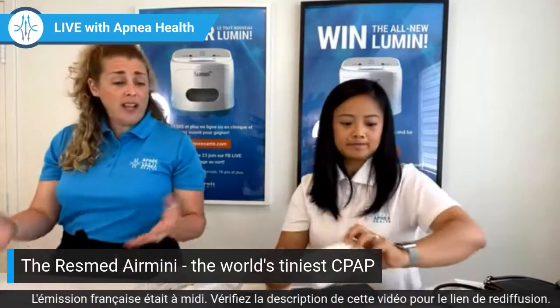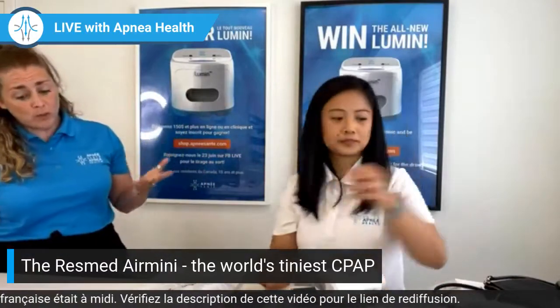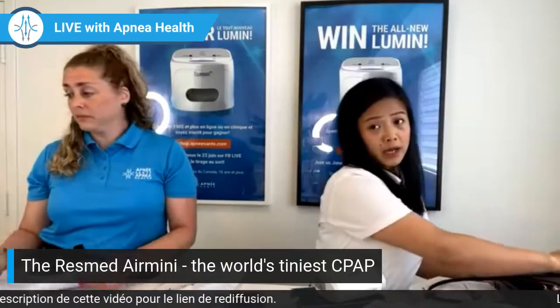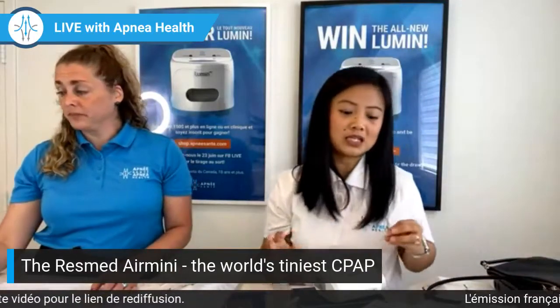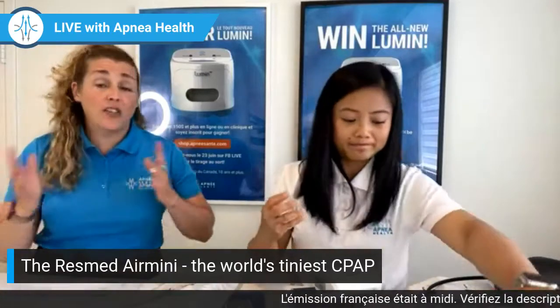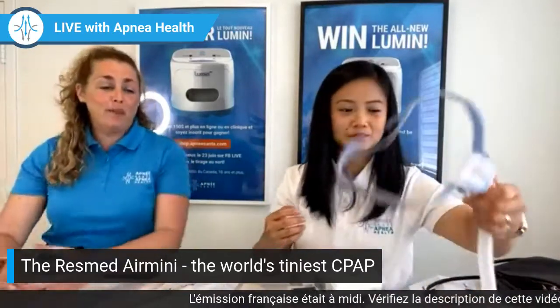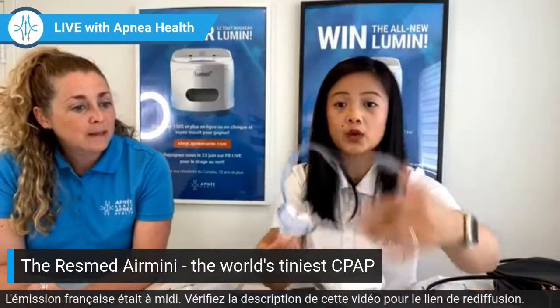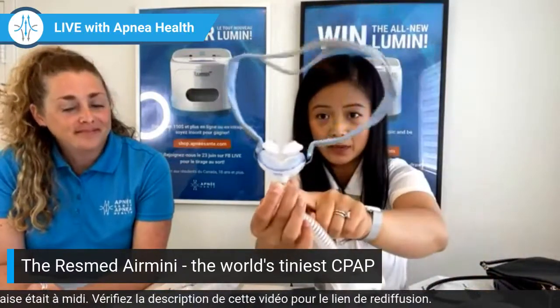Yes. So if that's the case, which masks are compatible with the Airmini? I did say it's a small number, but what's great is they made sure that there's one in each category. They thought it through, because everybody's different. So first, let's go over the pillow mask. You have the P10.